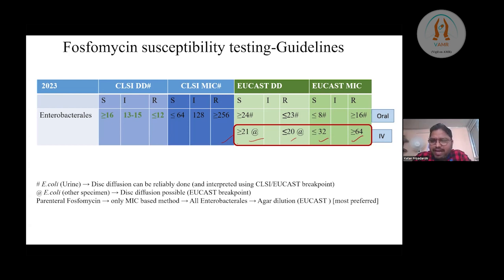If you look carefully, the minimum MIC is 8, then we have 16, 32, 64, 128, and then 256. So in this study, the range of testing is decided from the minimum, which is the susceptible breakpoint, to the maximum, the resistant breakpoint. We'll plan the study so that we cover an MIC of 8 to 256.